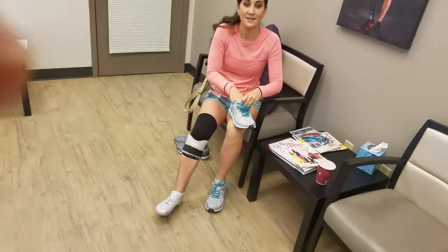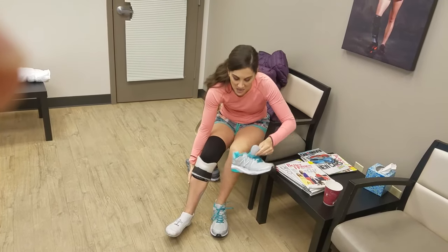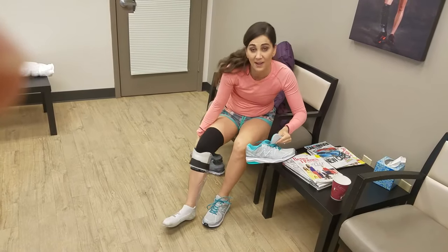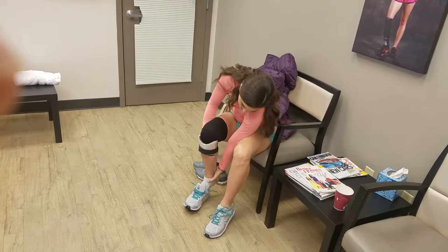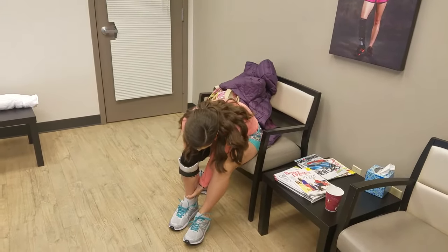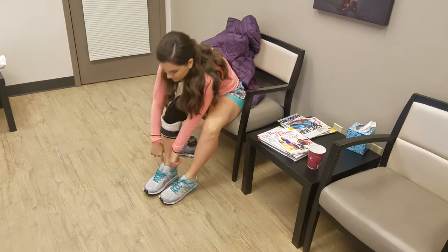Second try. This is for Carol because I know she would want to try it a second time. So I put on the device and I put it into the shoe here. Need a shoe horn, I think. Sit back in the shoe.